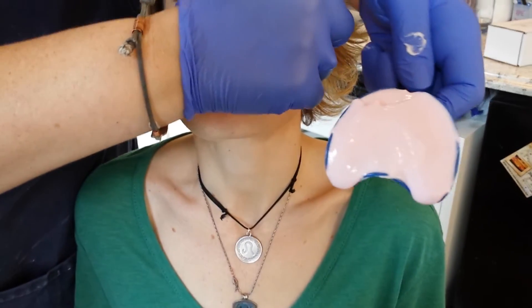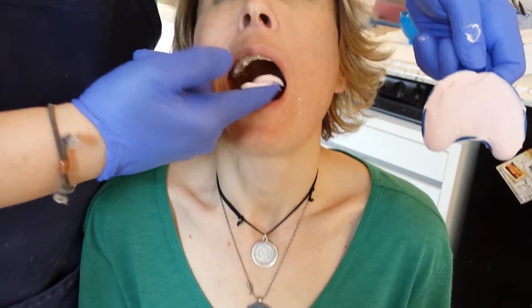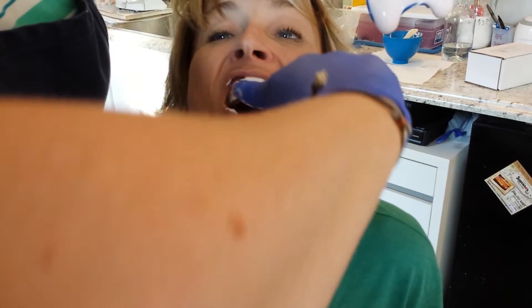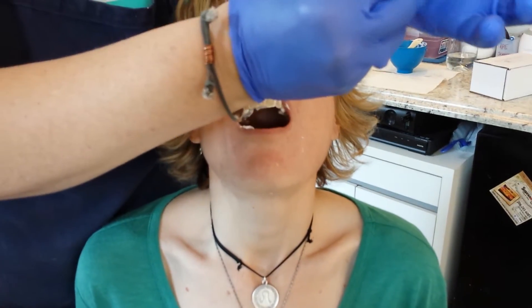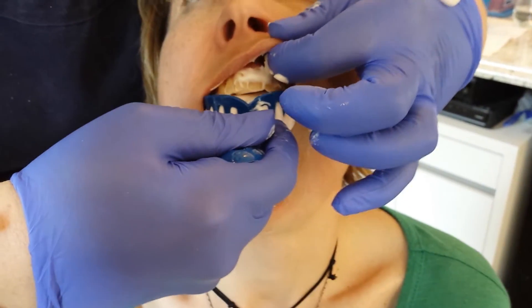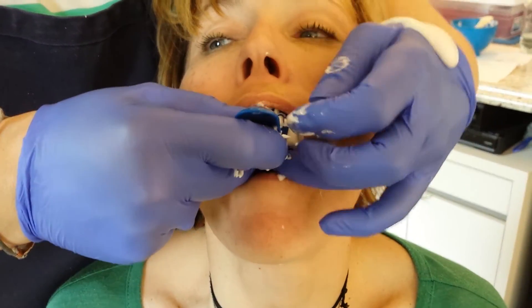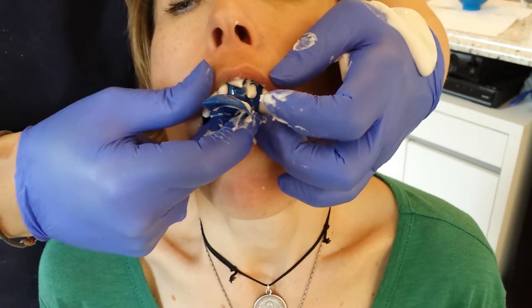Now we'll come over to our model Deanna and ask her to lift her head back just a little and open wide. Use what you have on your hand to coat the inside of the teeth on the lingual side, the occlusal surface, and also the buccal. This presses out any air bubbles and saliva bubbles that might be in there. Then go ahead and insert the upper tray, seating from the back to the front, keeping the lip out and away, pulling it toward the outer part of the impression.